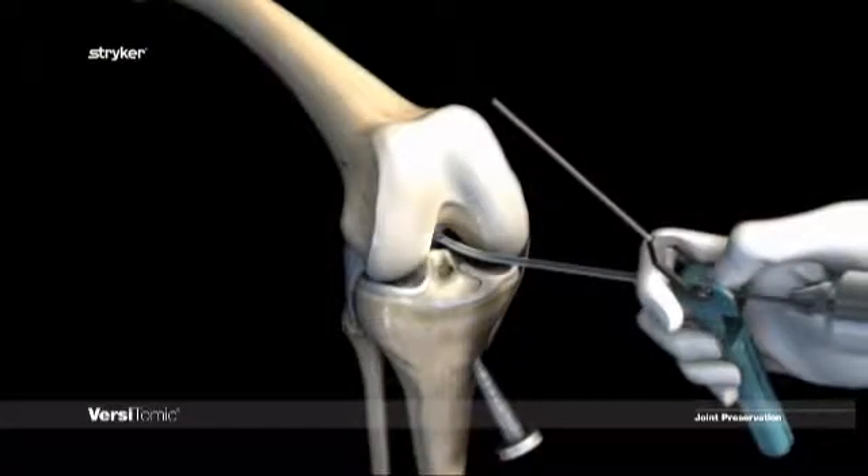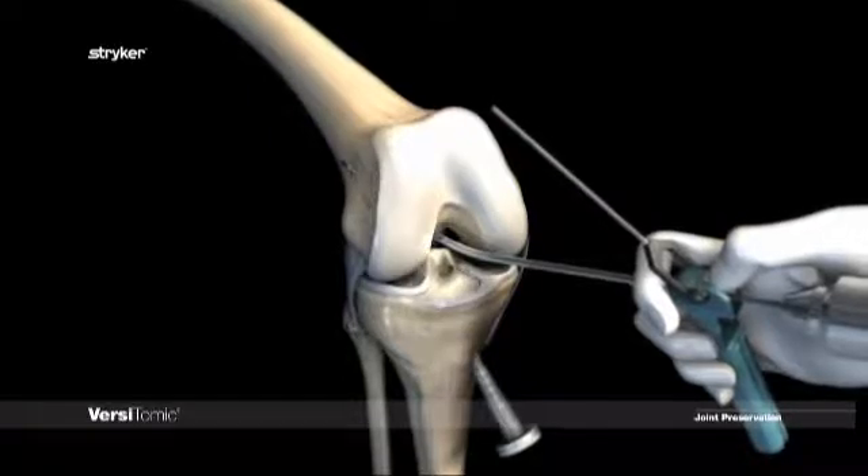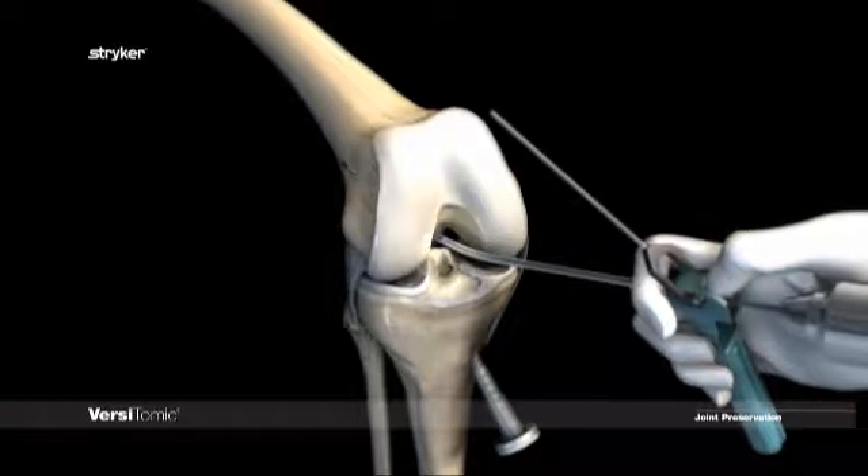The guide pin is then advanced in small increments until it exits out of the femur. Note: advancing the pin driver close to the guide helps prevent the flexible guide pin from wobbling during drilling and helps ensure solid advancement of the pin through the femur.